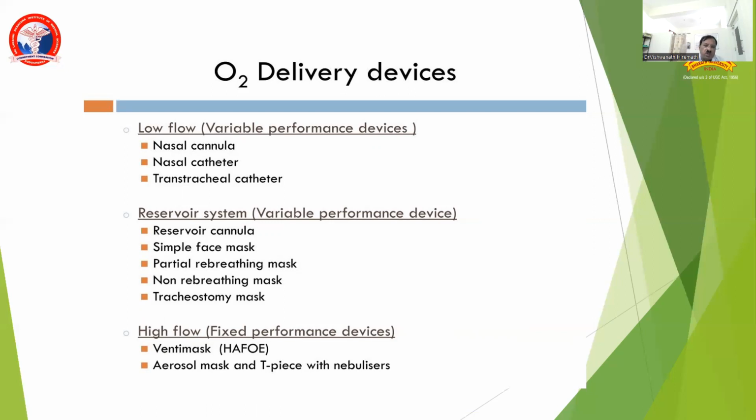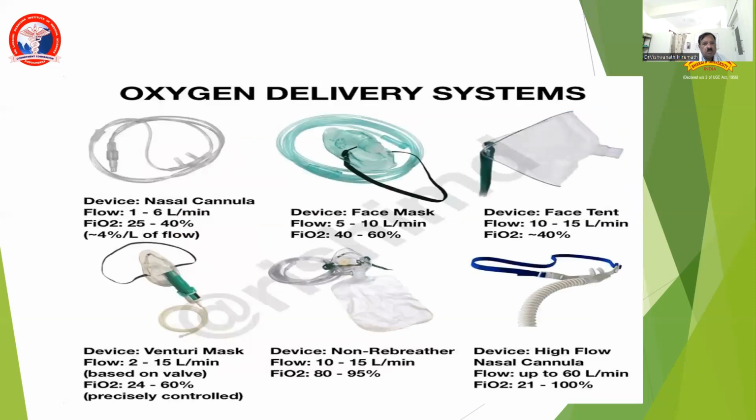High flow devices are also called fixed performance devices, which include venturi mask, high airflow oxygen enrichment mask, and aerosol mask. So these are the different delivery systems.